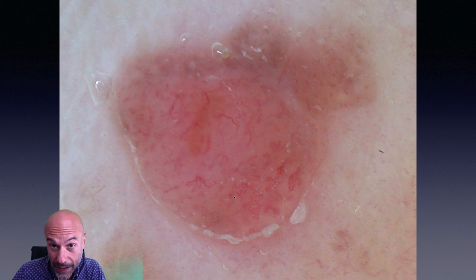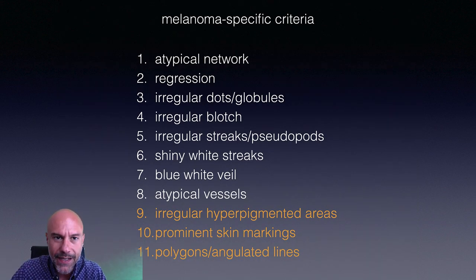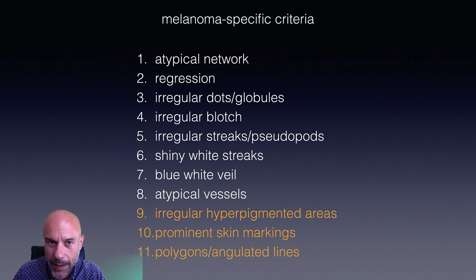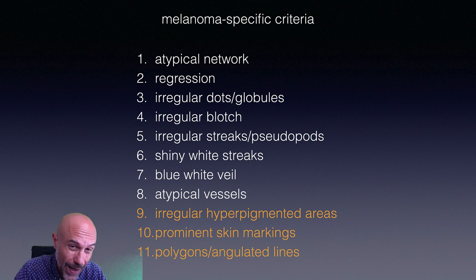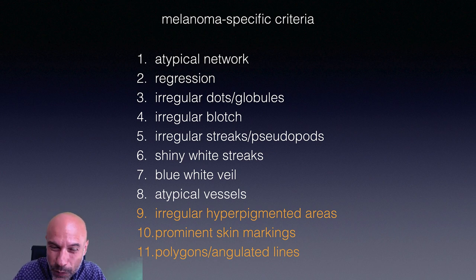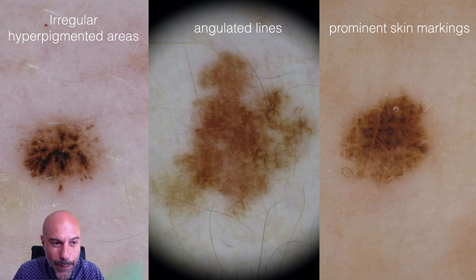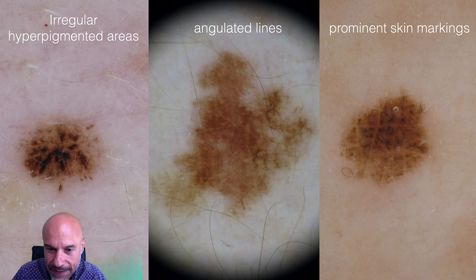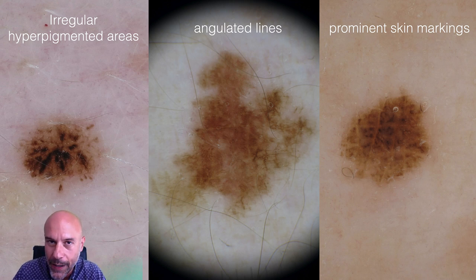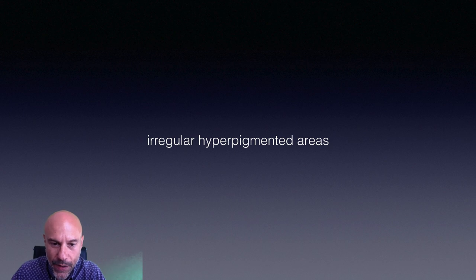These are the main melanoma criteria. Recently, a few additional criteria have been validated as specific for melanoma, especially important for very early melanomas — melanomas in situ or very early invasive melanomas. The most important new criteria are: irregular hyperpigmented areas visible on the left image, angulated lines which are quite similar to the rhomboidal structures of lentigo maligna, and finally prominent skin markings.